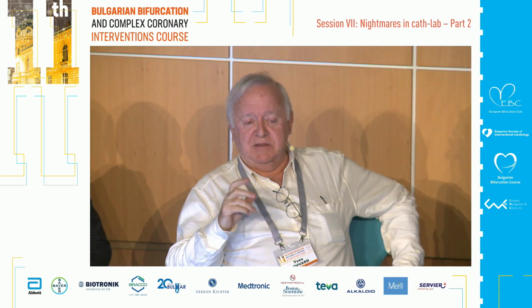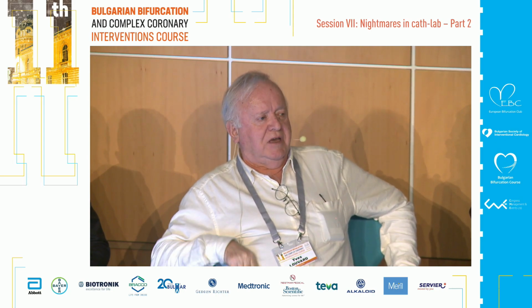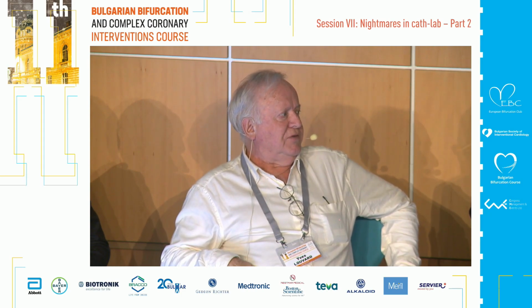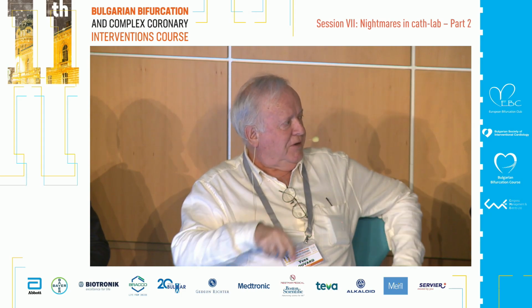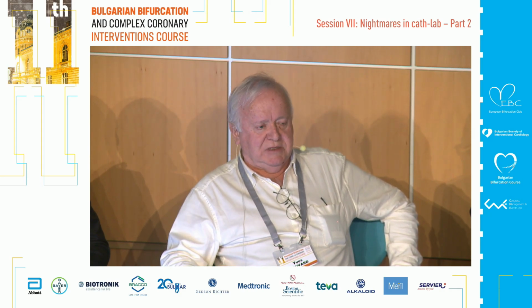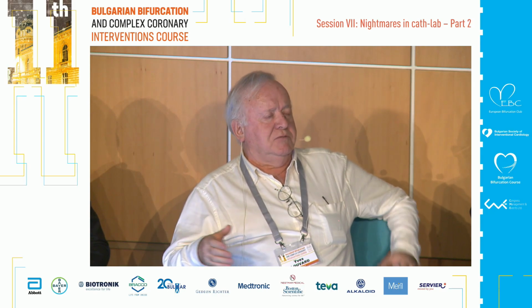Yeah. I had a case that looks like this. It was a lady. I did a direct antegrade puncture to treat distal lesions. I know this is a difficult technique. It was before echography. So I did the puncture, I did the treatment, and after that, the lady was fine when she was out of the cath lab. She was a bit agitated.